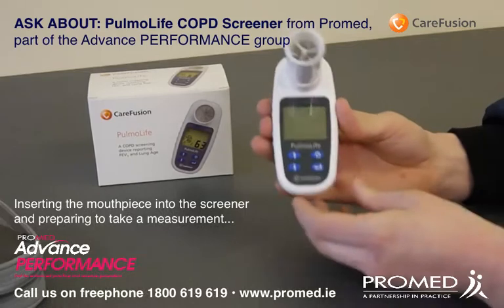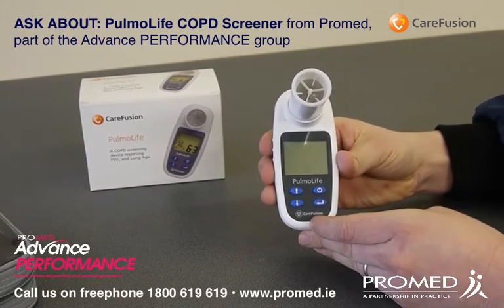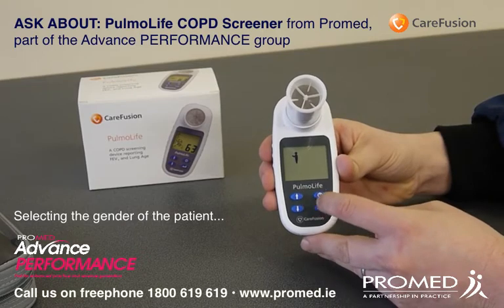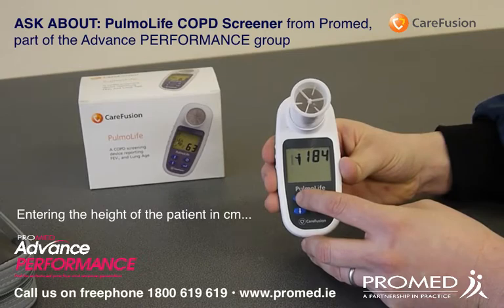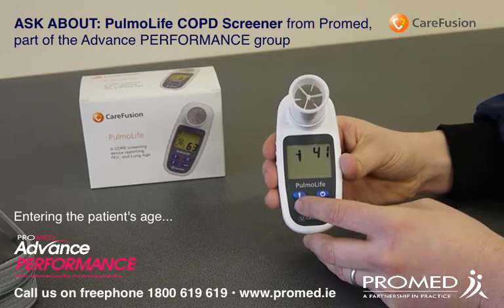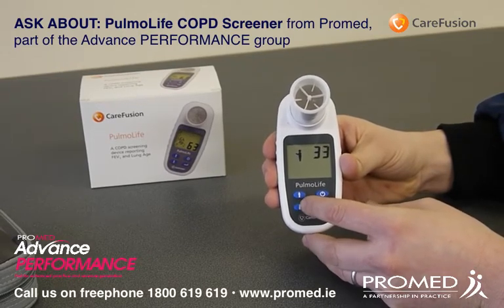We will turn the unit on and wait for it to initialize. Select the gender of the patient, be it female or male. We will now select the height of the patient in centimeters, then select the age of the patient, and then select the ethnic origin of the patient.